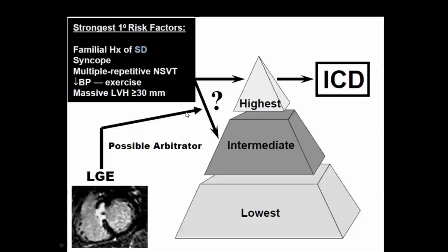So here we measured the amount of myocardial fibrosis. This is a two-chamber view. Again, there's an anterior fibrosis here and here. And so the amount was more than 15%. It's important for risk stratification.